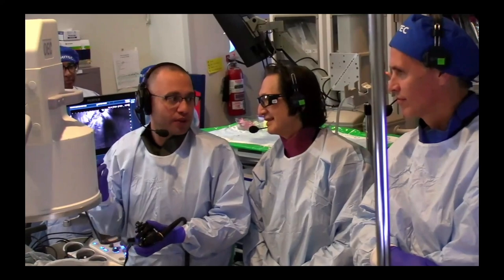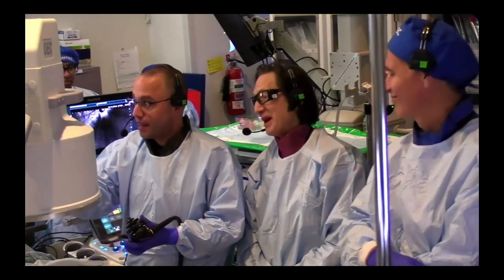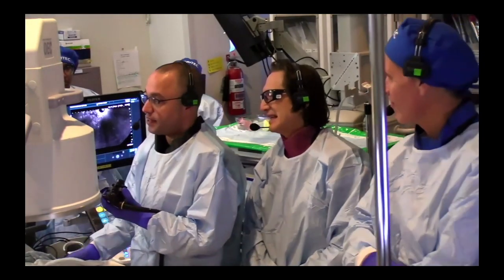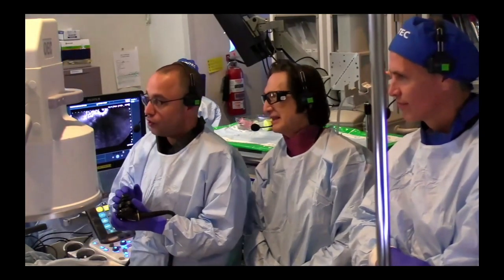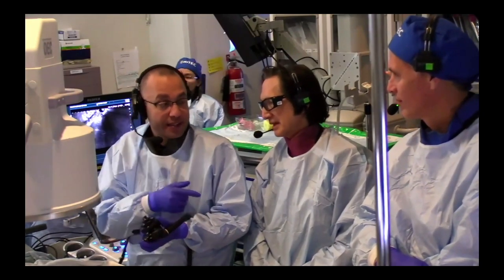We've had dislodgements during dilation. And you can get significant bleeding and pain. Patients have pain afterwards. And in this patient, we know there are varices around, and usually you lacerate varices or vessels around the Axios during dilation. And this can be hard to treat.